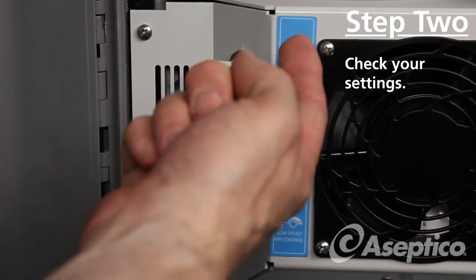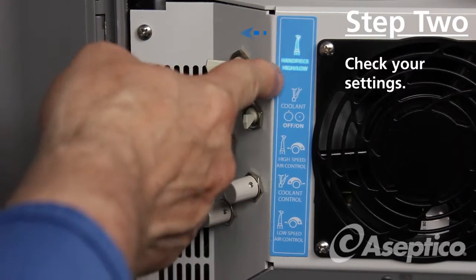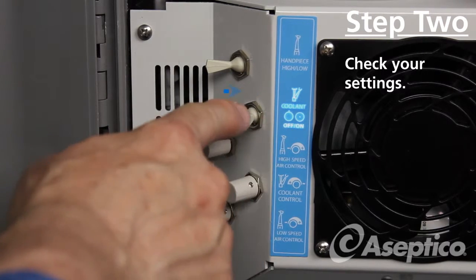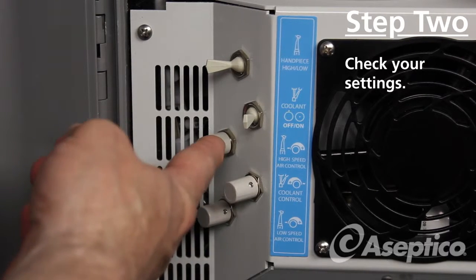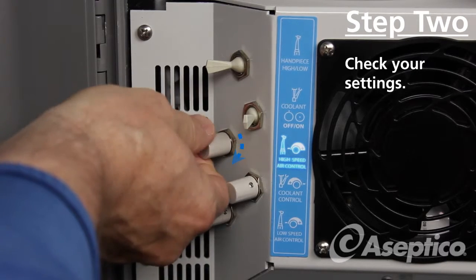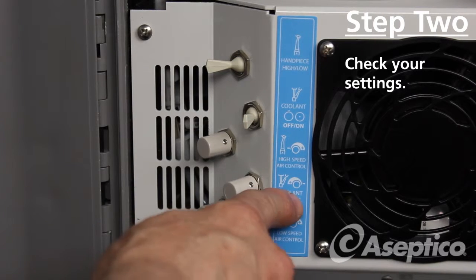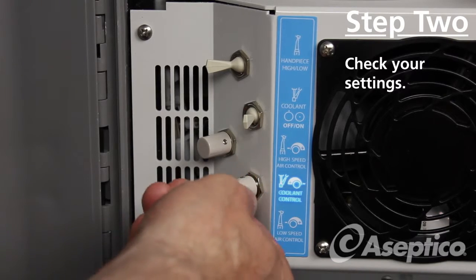At the top of the unit, make sure that your high-speed handpiece is selected — here the high is on the left. Make sure that your coolant is on; on is in the right position. Then make sure that your high-speed air is on, and you can adjust it by turning clockwise. And then we've got our coolant control — you want to go the opposite direction on that one, counterclockwise, and you'll get more coolant.